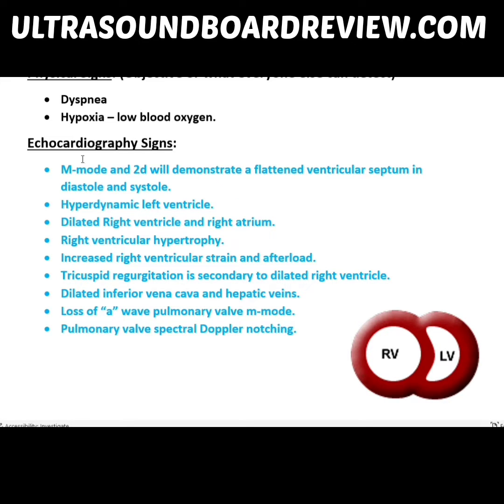So these are the echocardiographic signs that you'll see. You'll obviously see an enlarged RV. It'll be hypertrophic. Your right atrium will be dilated. You'll see some TR, and you'll have a flattened septum.